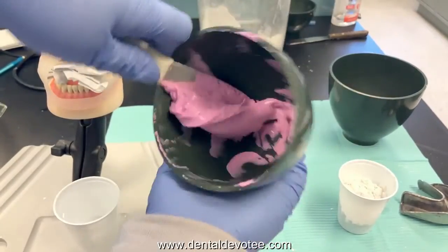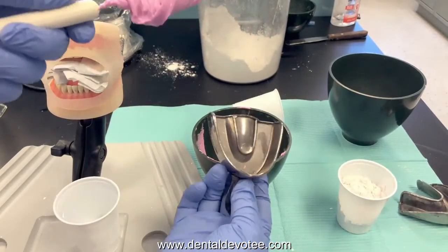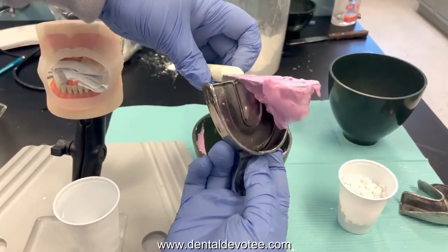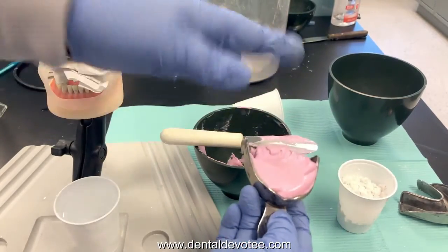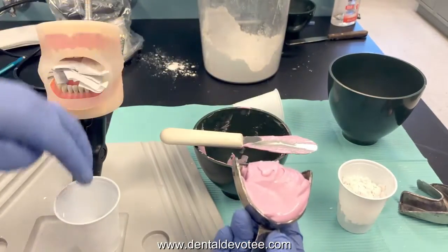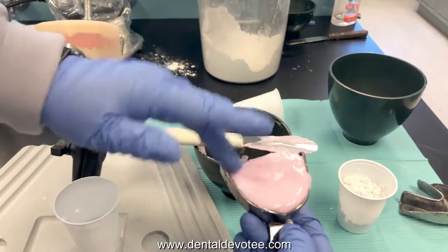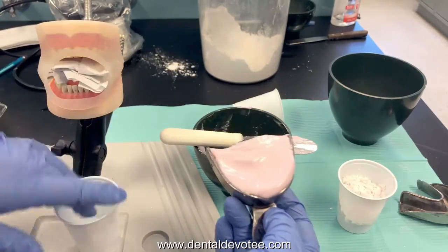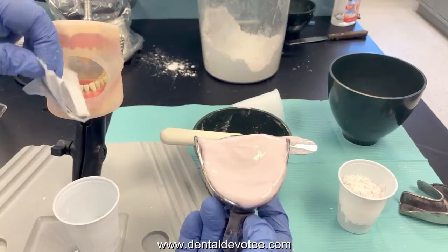I'll do the maxillary first. Scoop up all the material on your spatula. Take your maxillary tray, load it from the posterior and press it to the front. Don't do a lot of wiping back and forth — that just wastes time. Dunk your fingers into some water and smooth out the surface. The front of the tray should have more material than the back — more material in the anterior, less in the posterior. It's getting very light pink, almost white — it's time to get it into the mouth.